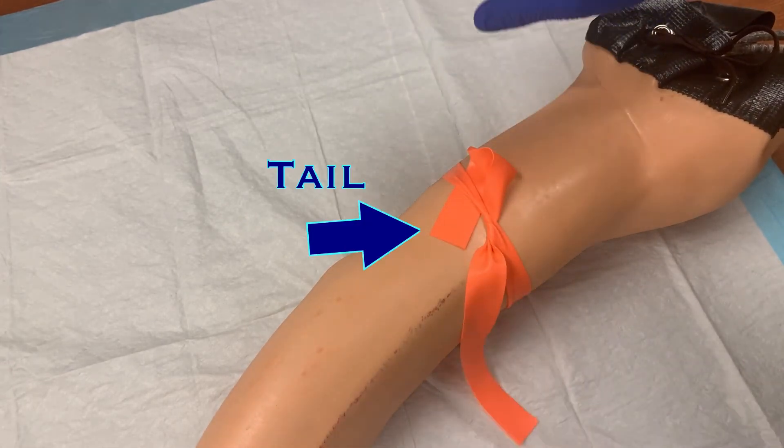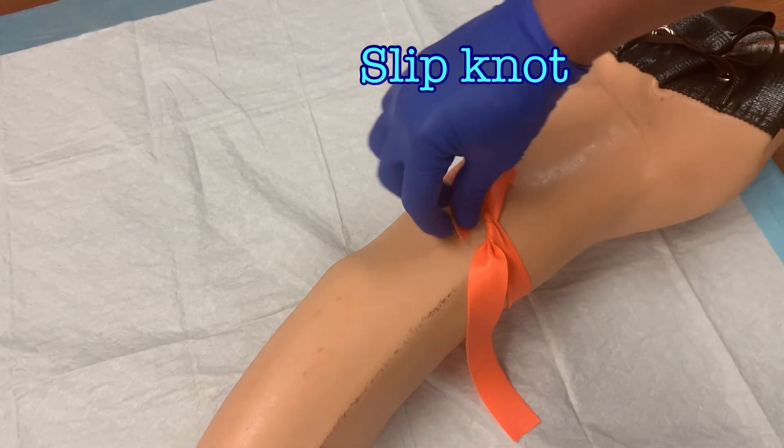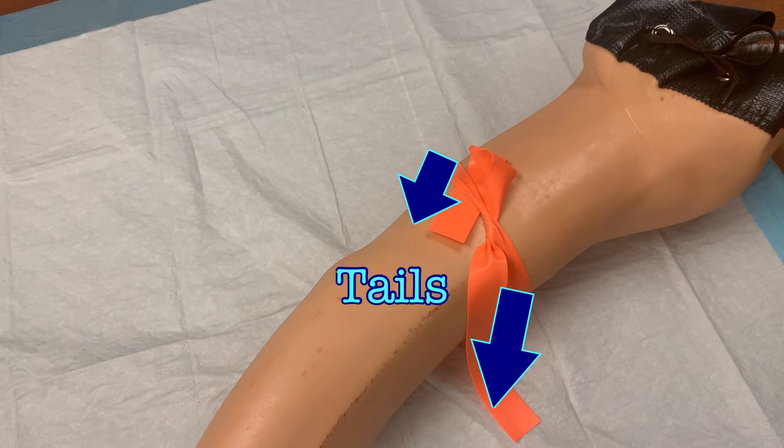Do not put the tail end of the tourniquet under, because that will be difficult to remove. What we want to do is create a slipknot that is easily undone by pulling on one of the tails. So when you are done, both tails should be pointing in the same direction from the tourniquet. Pointing in the opposite direction should only be the loop.